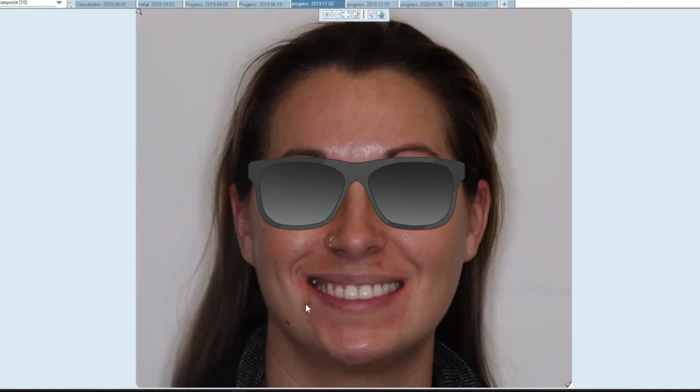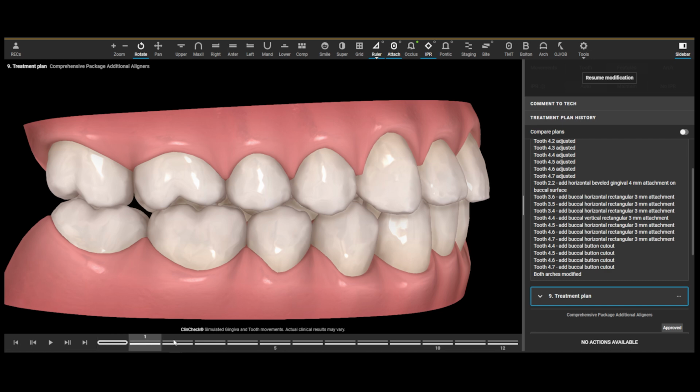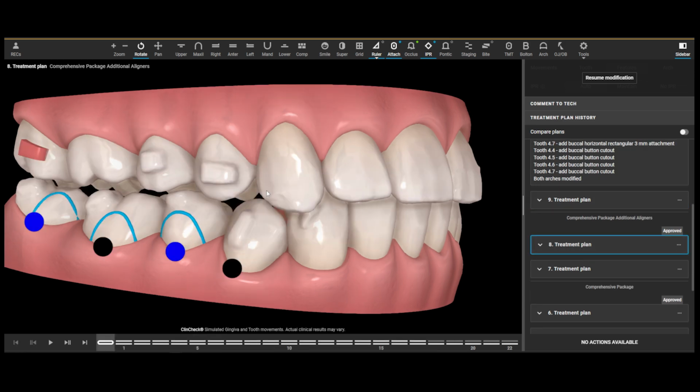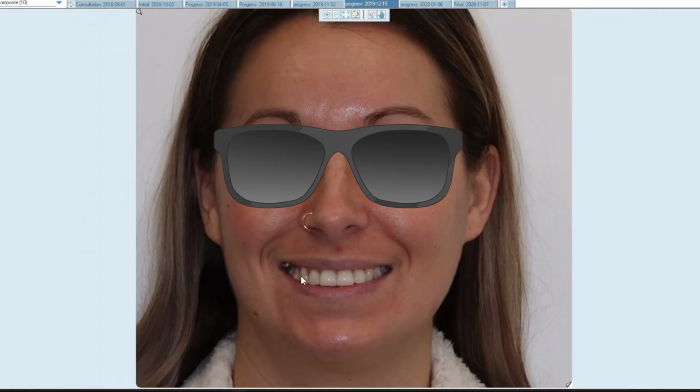So here's where we're at later on, and she comes back again. And this is the one that I clicked modify on, so I'll go back. But here's where she's at on her next batch. Right, so in this case, I didn't even actually get any trays. Now, you can't do this nowadays, but I didn't even get any trays to show more intrusion in the back. And actually, it would have been, I guess, still maybe on this one. But we just kept intruding these teeth more and more with more trays. Because just with more intrusion of the elastics, that gets her to the point now that her bite's looking really good.